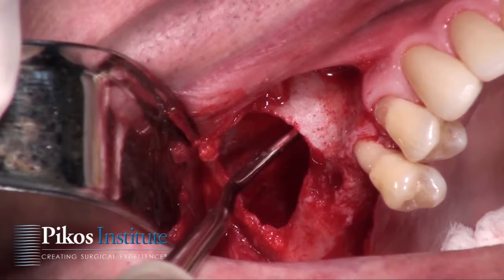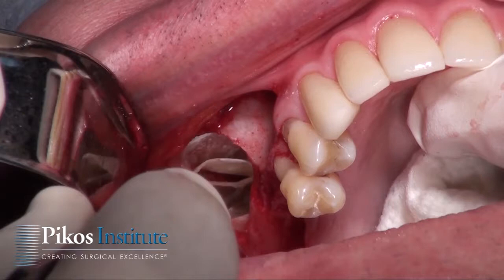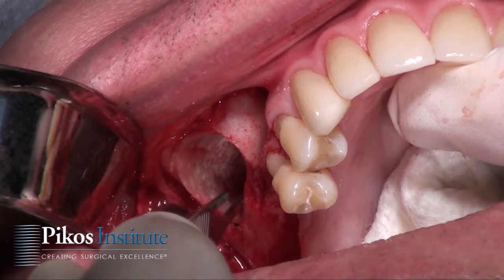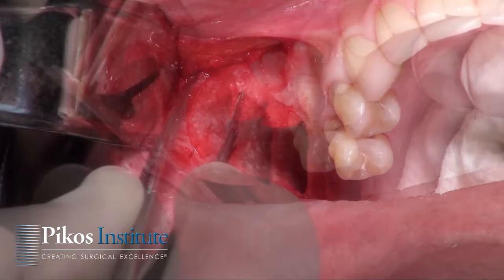As I've mentioned in this and other modules, whether we have perforations or not, I'm placing a collagen membrane. We've hydrated it and we're going to introduce it into the sinus. The decision to fixate externally is dictated by a couple of things. Indications for external fixation include a medium, large, or complete tear — whether intentionally made to remove pathology or inadvertent — as well as a very thin membrane where, to the best of our knowledge, there's no perforation.